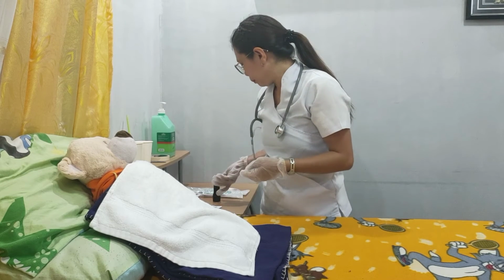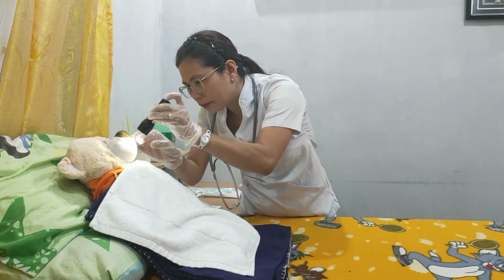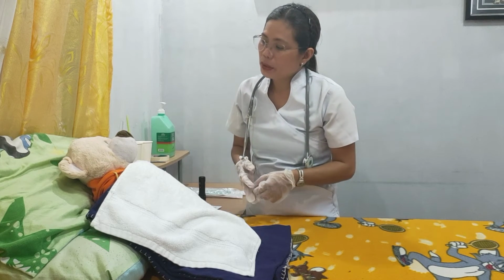After it, assess your patient for any facial or nasal passage issues using a pen light. Check the nostrils and the mouth of the client because tube passes more easily through the nostril with largest opening. Ma'am, I will just check your nose.